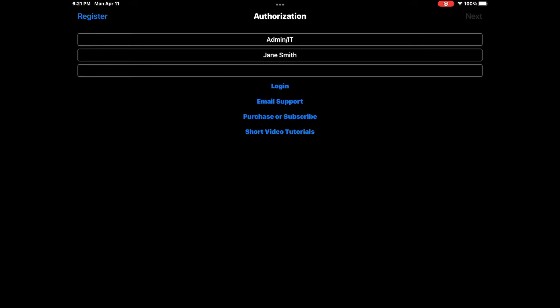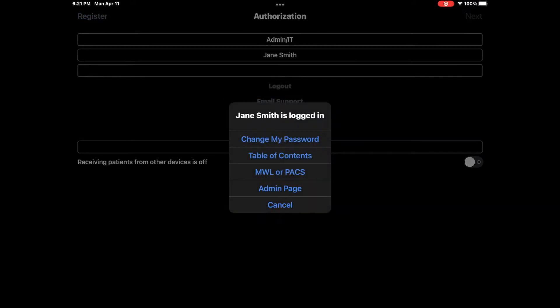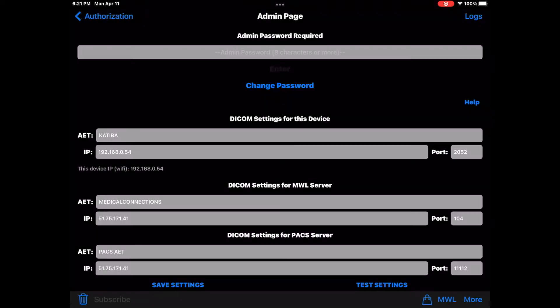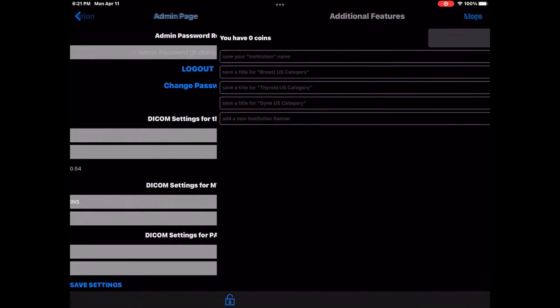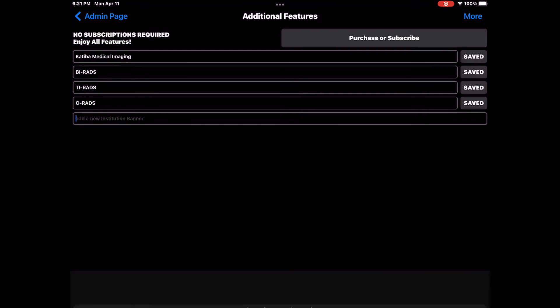Log in with your Admin IT account and go to Admin Page. Tap Shopping Bag icon. Tap the field marked with Add a new institution banner.